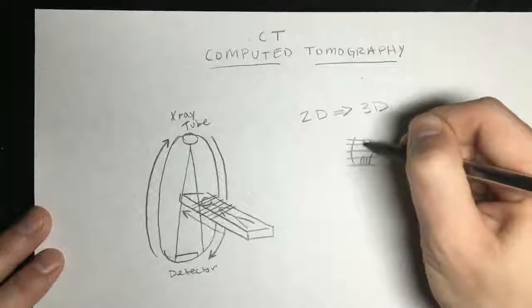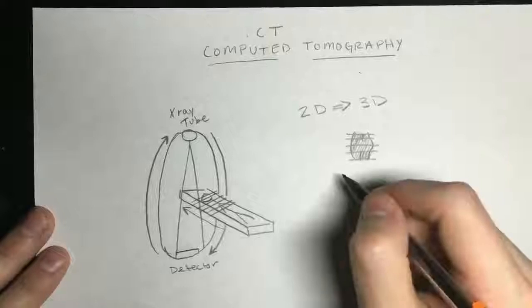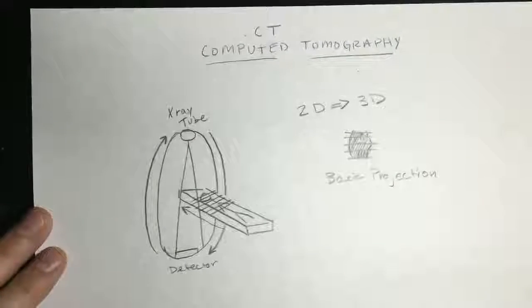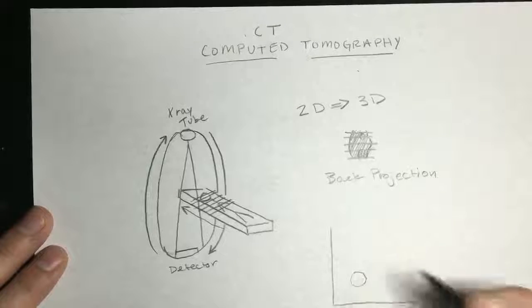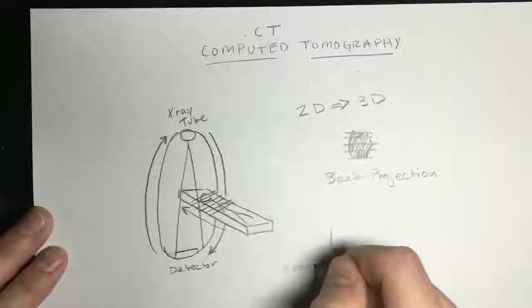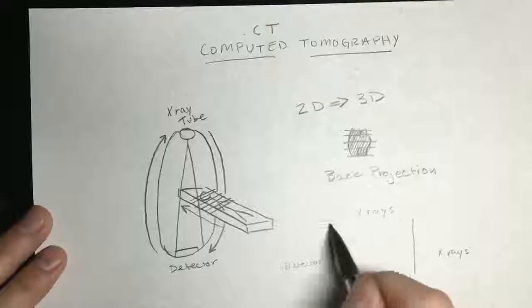And again, the main difference in X-ray and CT is that CT takes cross-sectional images, which it then compiles and stacks upon one another to create the 3D image. And it does this by utilizing back projection, which is essentially the CT creating an image from the light that it does not detect. And the spatial resolution of this machine is around 0.4 millimeters.